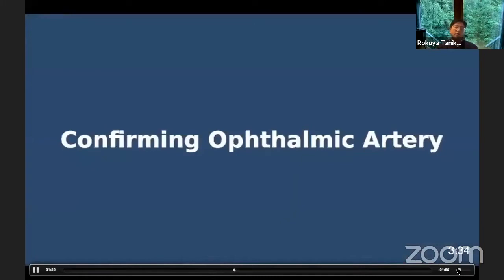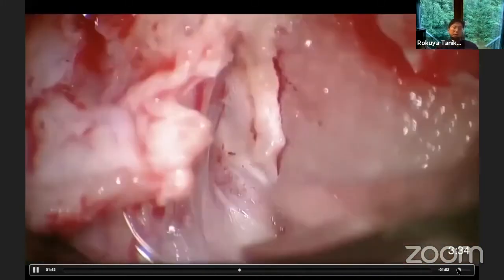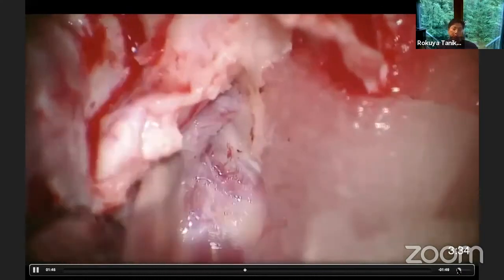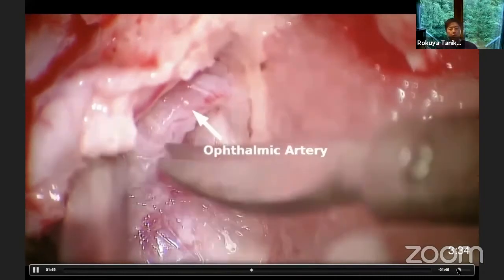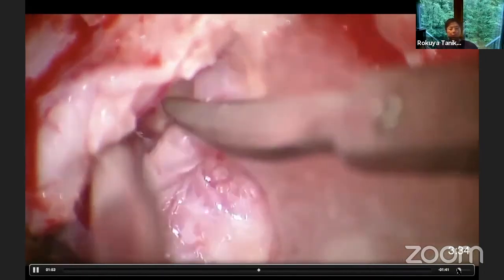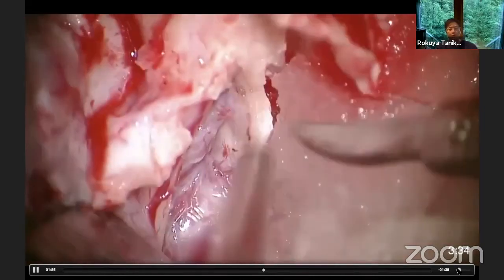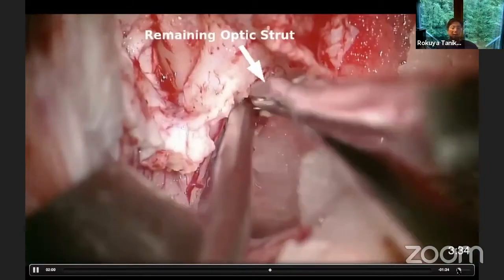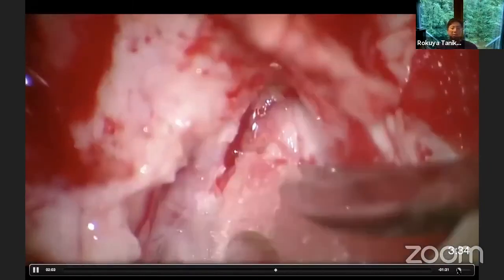Then you can open the optic sheath. Now we can expose the C2 proximal segment, exposing the ophthalmic artery origin. Medial to the ophthalmic artery, I am confirming the distal dural ring medial part. Here is the remaining optic strut — just under the ophthalmic artery, the superomedial part of the distal dural ring can be incised, continuing to the medial part of the distal dural ring.